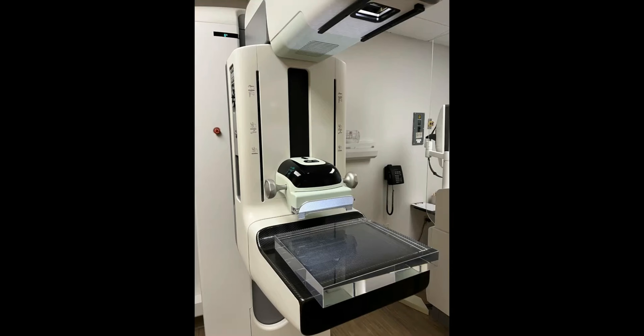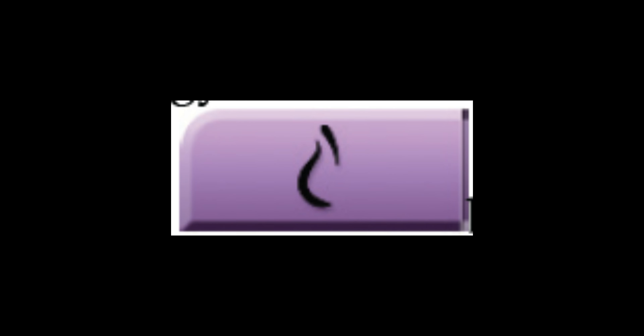We'll want to navigate to the admin quality control technologist tab and select artifact evaluation. You'll want to set up the flat field phantom as seen on screen, ensuring that the phantom covers the entire field of view or covers all of the white lines on the breast support. Move the compression arm to between five and seven centimeters as pictured, or the same position as the gain calibration.